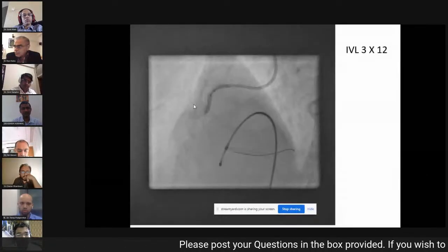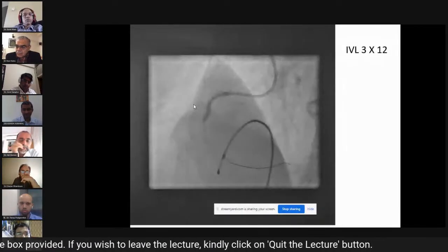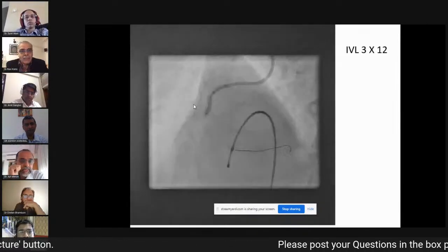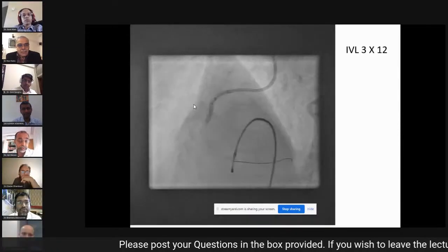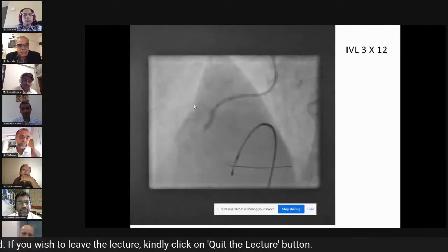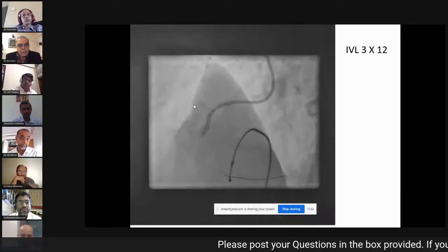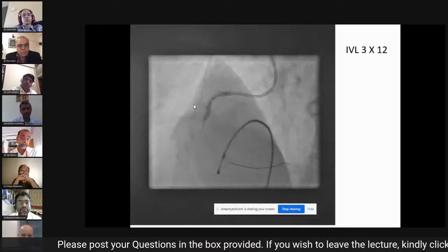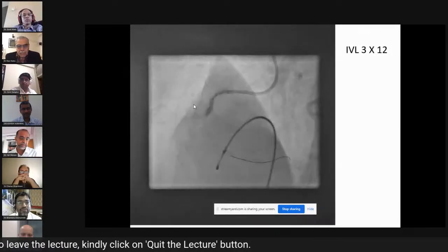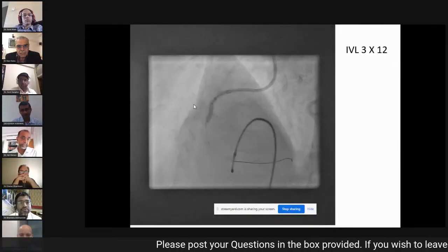Okay, see, two to three things. One is if you see the initial angiogram, the uptake of the RCA is a little upward. It's a little difficult uptake of the RCA. So that itself would have given an idea that with any of the guidings that you use, the most important thing that you would require is a good guiding support. Second, like you said, the balloon crossed the lesion and inflated there, but you could not recross the lesion with an already inflated, pre-inflated balloon, which means that there is definitely some calcium there. There's something which is obstructing the free movement. It could be a calcium spicule, it could be a calcium blob at that point. An OCT would have helped, but you couldn't get an OCT catheter down also.